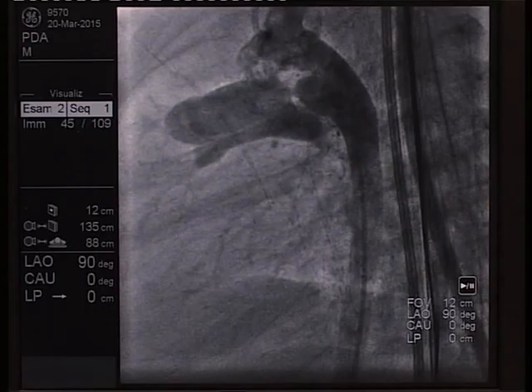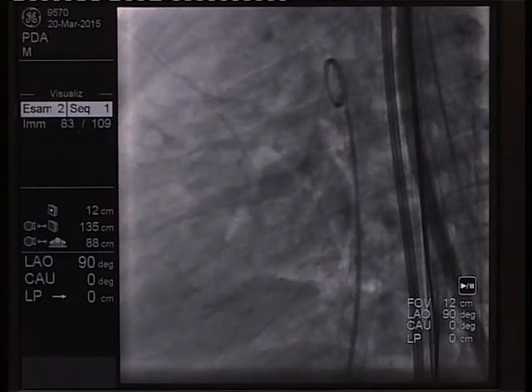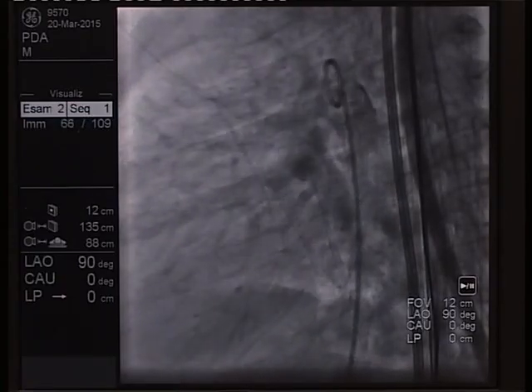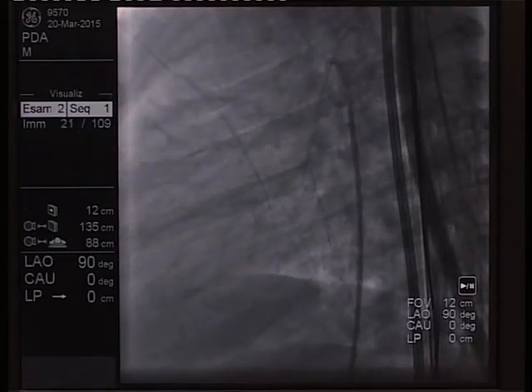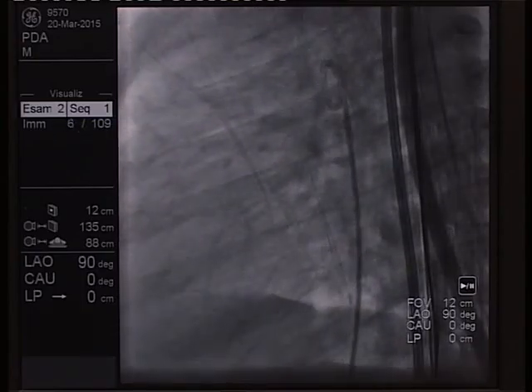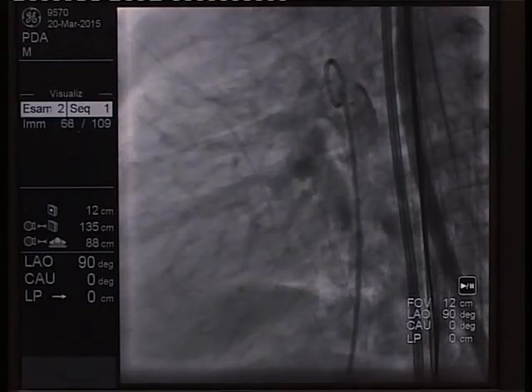Okay. Right. So now looking at the angios, this is quite a large duct with a very good ampulla. Who in the audience would use an ADO2AS? We are concerned about the idea of using this device by the arterial side, but other times it worked well like this.